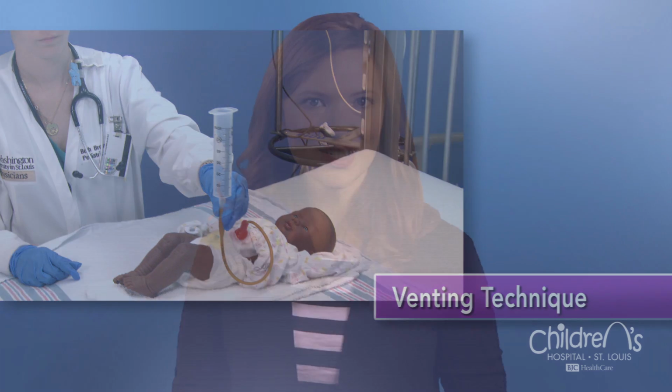Most children who have gastrostomies can burp or pass gas on their own to relieve the excess air in their stomach. However, some children have problems doing this. When this happens, you can help relieve gas from your child's stomach using a procedure called the venting technique. Follow these steps to use the venting technique using a syringe.